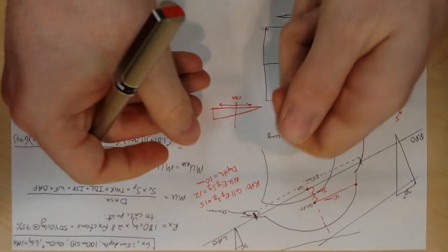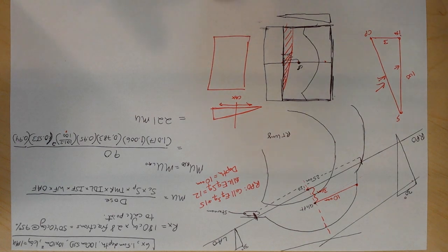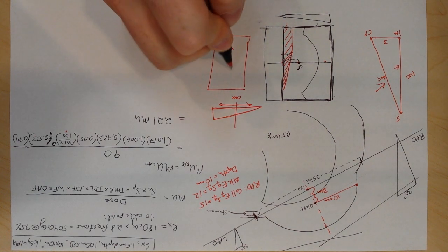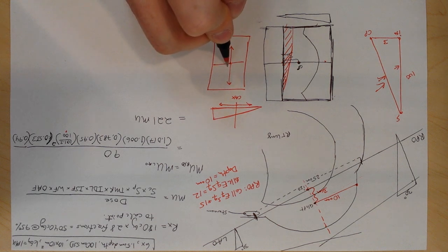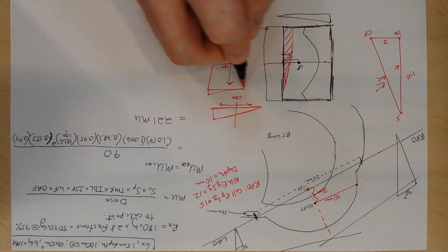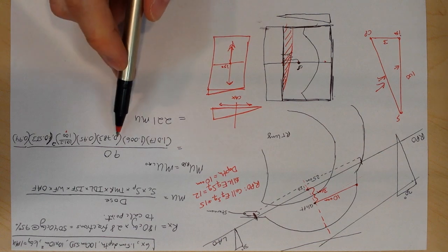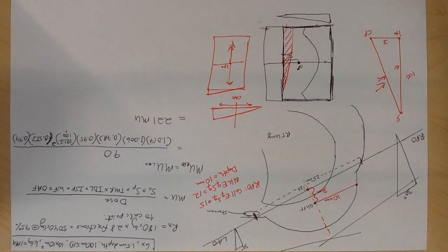And then if I turned the wedge up and looked at it on end, and this is ISO, and if my calc point is anywhere along the longitudinal direction of the wedge, try and draw this three-dimensionally, then I use the non-wedged off-axis factor. Okay, so I look that up, and I'm at 0.94 for 3 centimeters off-axis for a 30 degree wedge in the thick direction. Okay, you plug and chug these numbers and you get 221 MU.